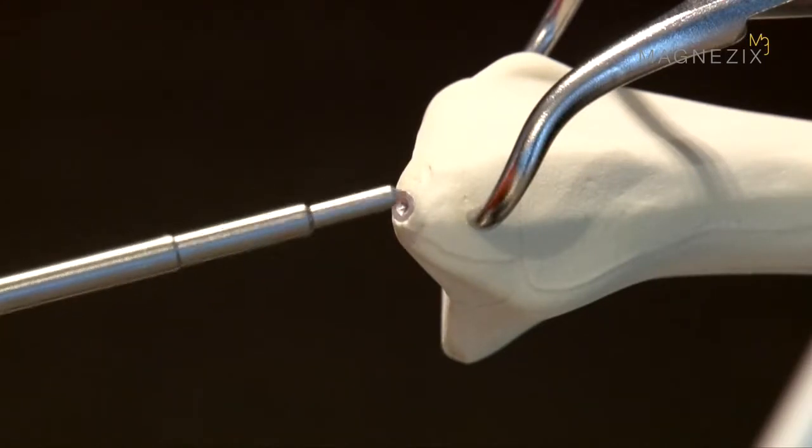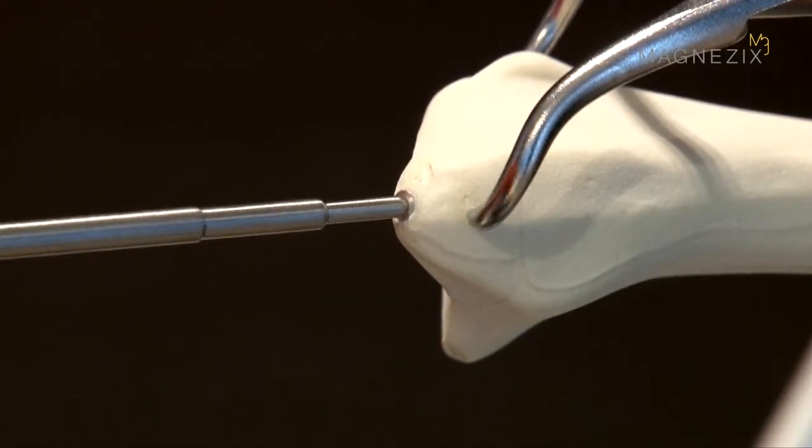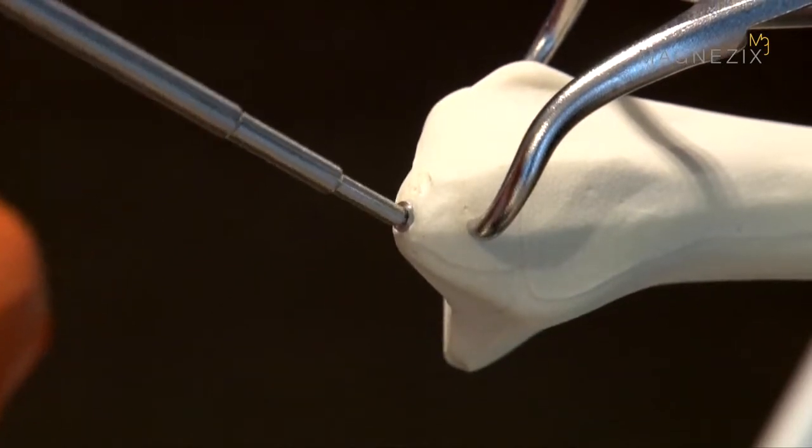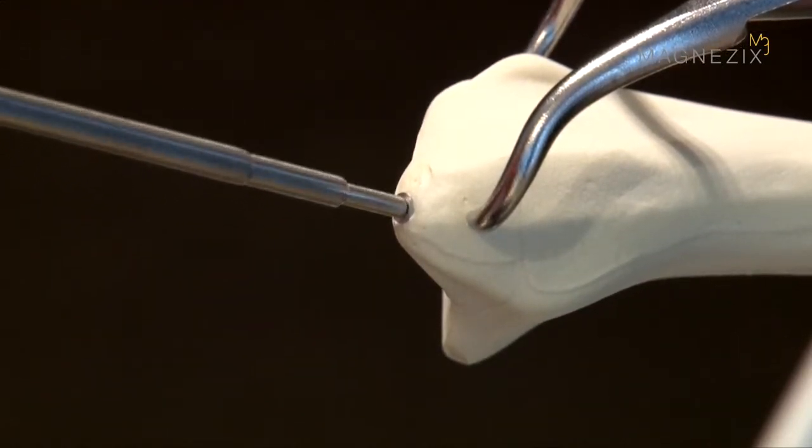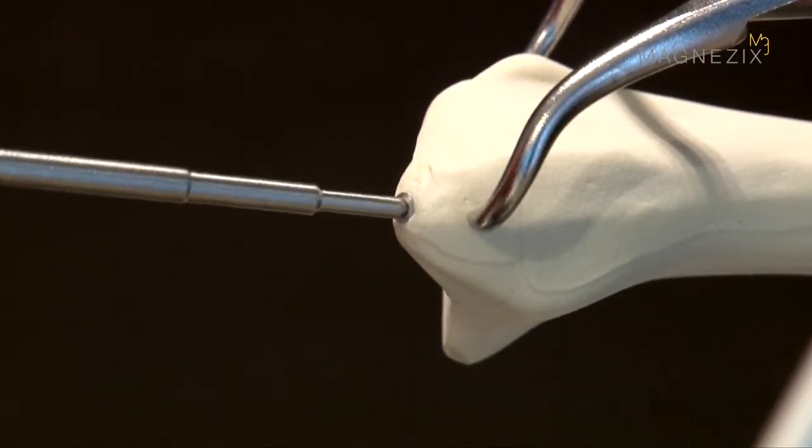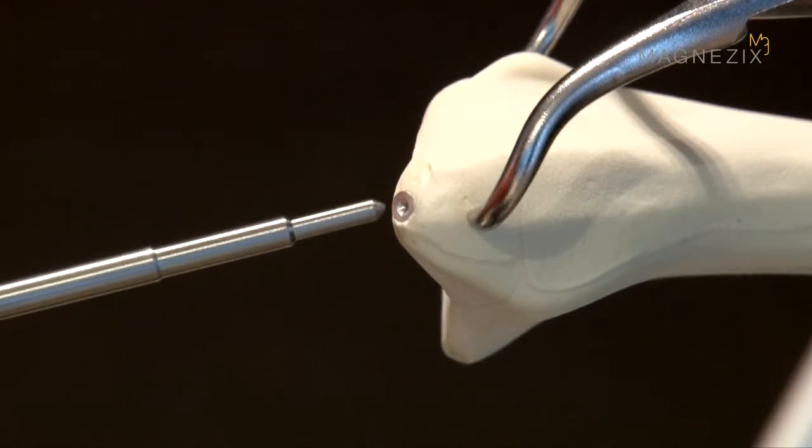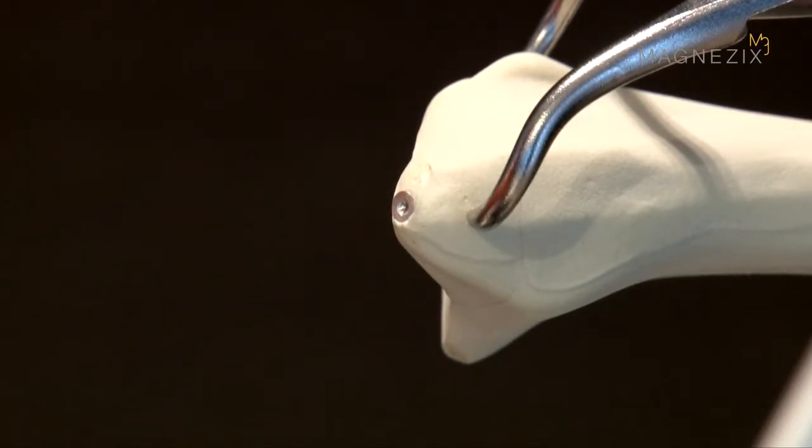Only the impactor insert is used for the last few millimeters of the insertion process. The recess in the head of the pin helps position the insert centrally. This recess also reduces the risk of the insert slipping off the pin head. This ensures a better view of the implant.